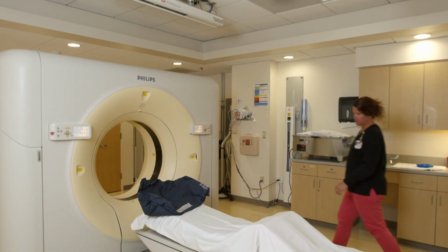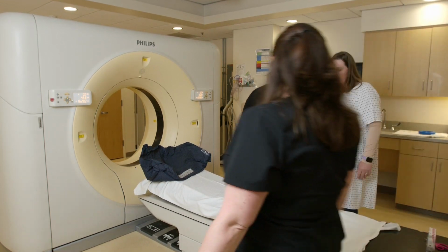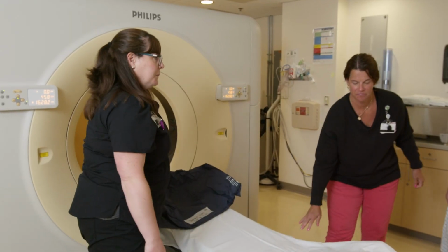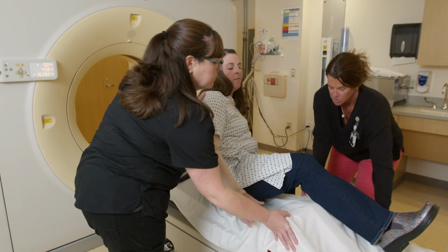Before treatment starts, you'll have a procedure called a simulation appointment, which may also be referred to as your mapping. These terms may be used interchangeably. The purpose of the simulation is to set you up like you're going to have radiation treatment, but instead of treating you that day, we just make a scan that we use to create your radiation plan. You've had CTs before, but this particular CT scan is to have you in a position that is reproducible each day for your treatments, so we can accurately and precisely treat you each day.